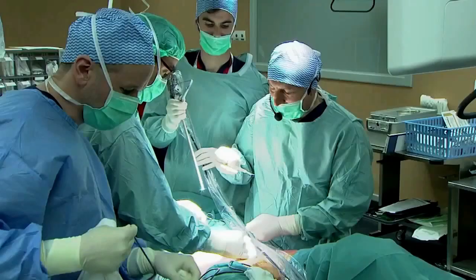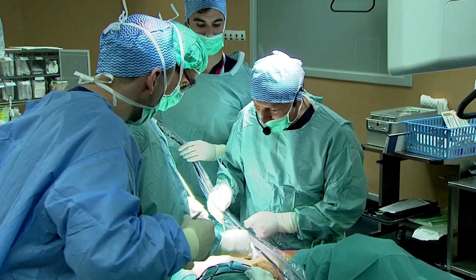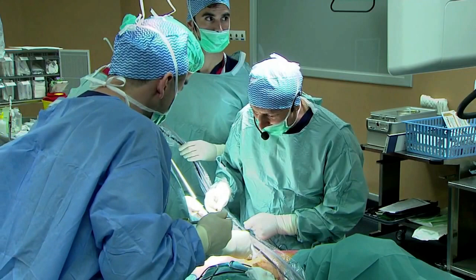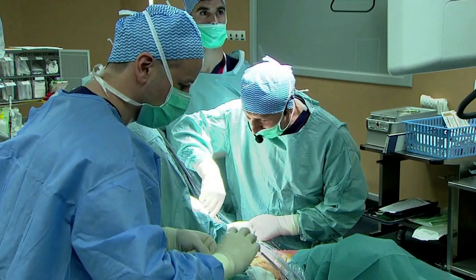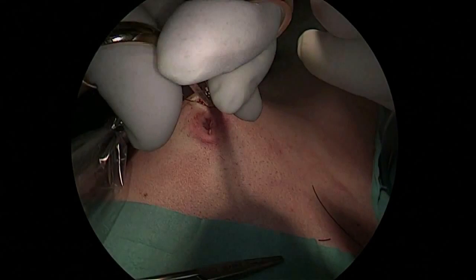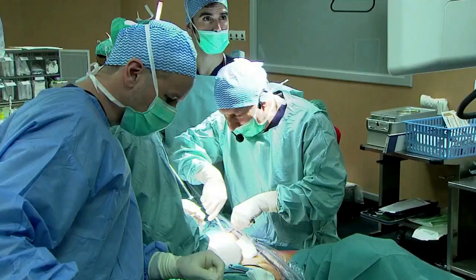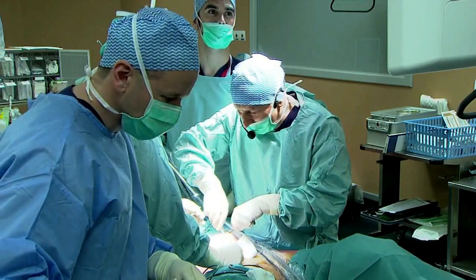Okay, I am very happy to be here because now I'd like to show a Millin technique for adenomectomy for a large adenoma. As you know, there is a big competition about this technique in the last years, because there are different techniques that we can offer our patients to treat a big adenoma, like endoscopy with holmium laser. But I think that you can also use a laparoscopic approach, especially when the adenomas are very, very large.